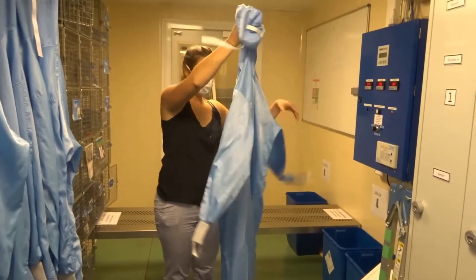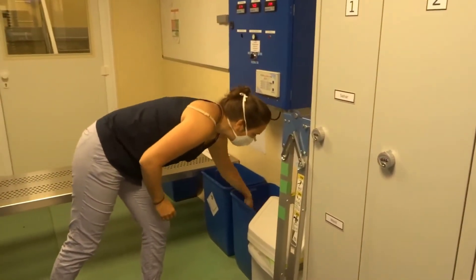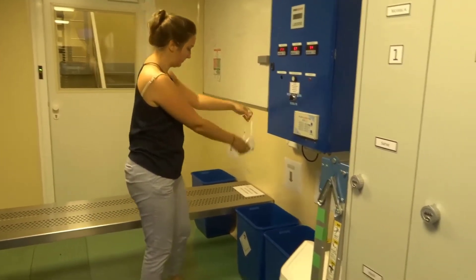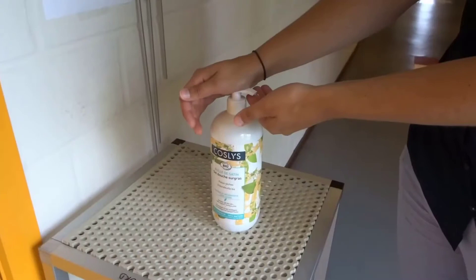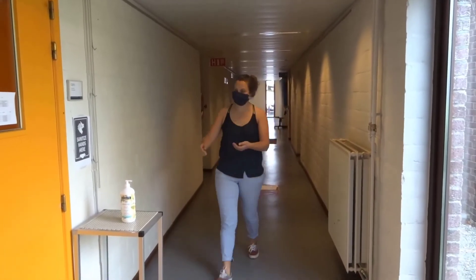Alternatively, if you know that you are not coming back before the end of the week, you can directly put the cleanroom garment and your mask into the right bin for cleaning. You are now free to exit with your badge and sanitize your hands again. We hope to see you again, and until then, be safe.